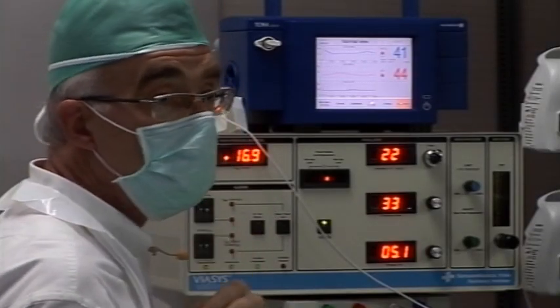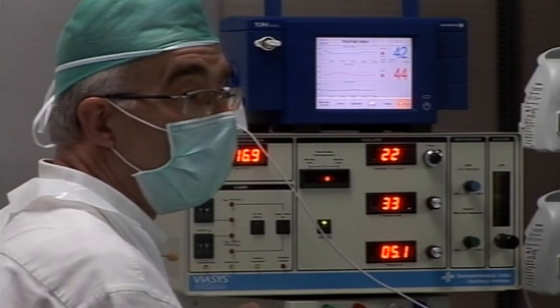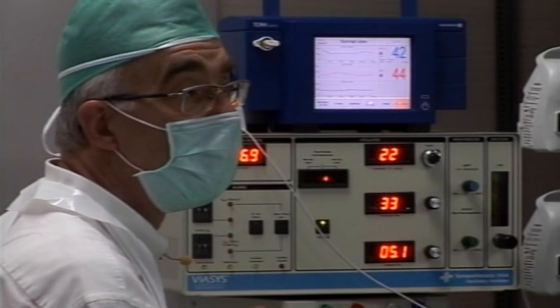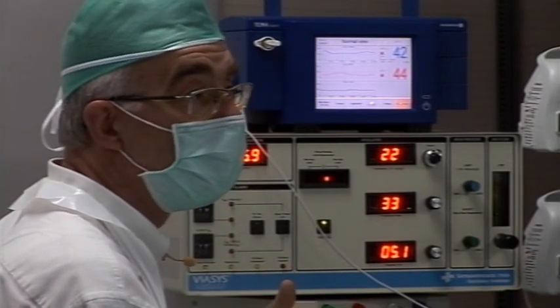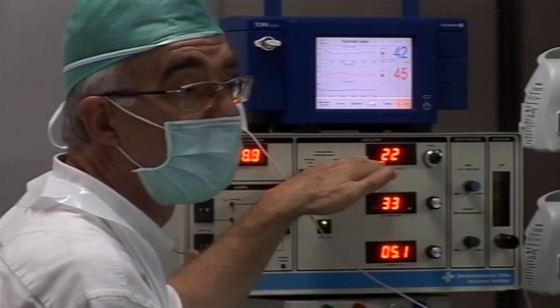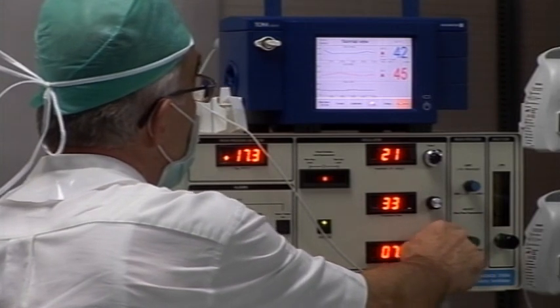In neonates, there is no reason to change 10 Hertz. If you have a 500 gram baby who has a too low PCO2, you just decrease delta P down to 5 or 6. You can easily go down to, I will show you.